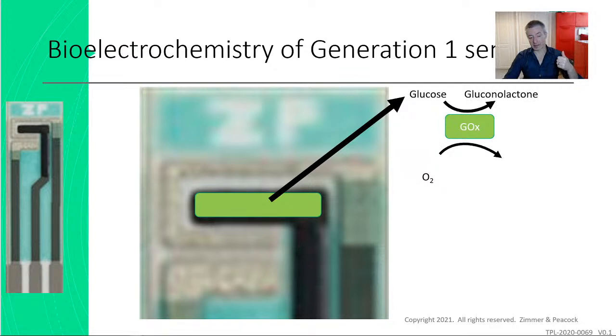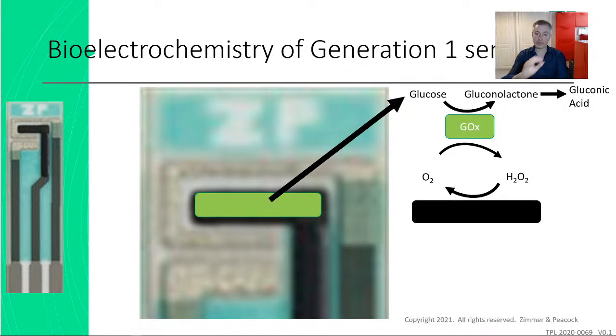So you have essentially reaction kinetics. And then, unusually with a glucose sensor, you also have a heterogeneous electron transfer across an electrode, which also has a temperature relationship. So in a glucose sensor, you've got many parameters that could be affected by temperature. It could be the diffusion, it could be the enzyme kinetics, or it could be the heterogeneous electron transfer across the electrode.